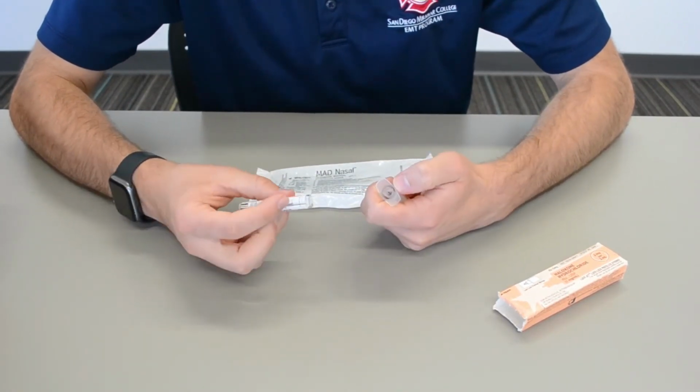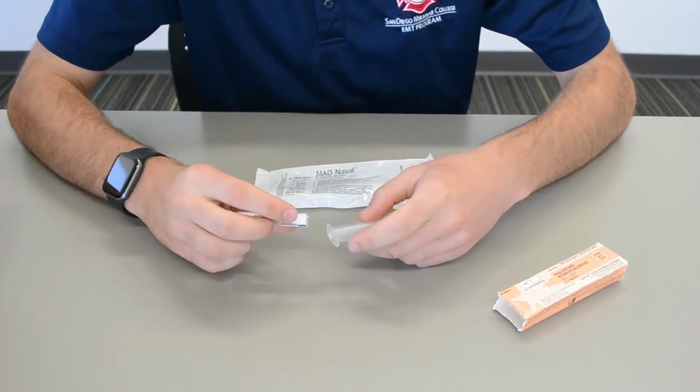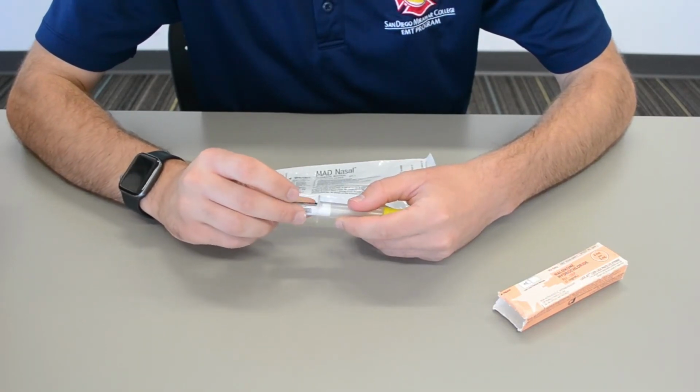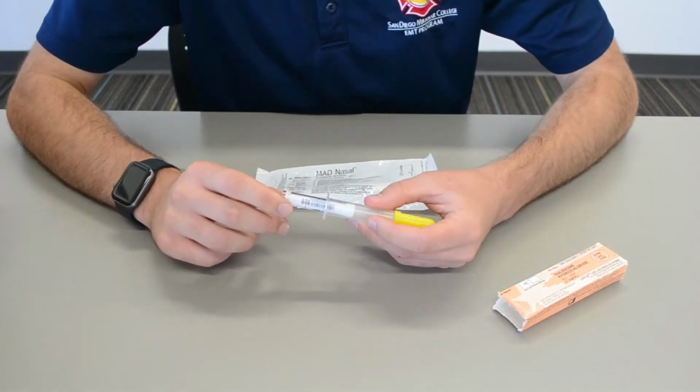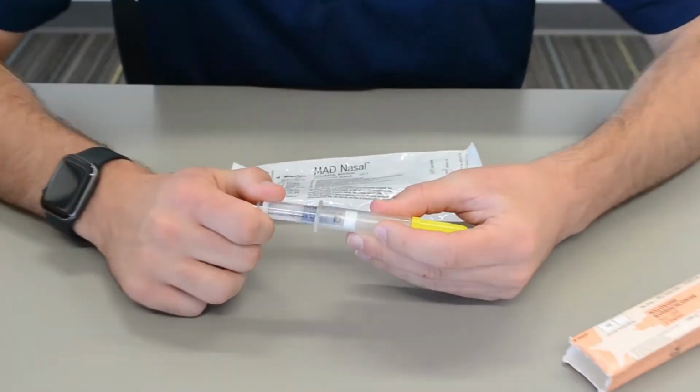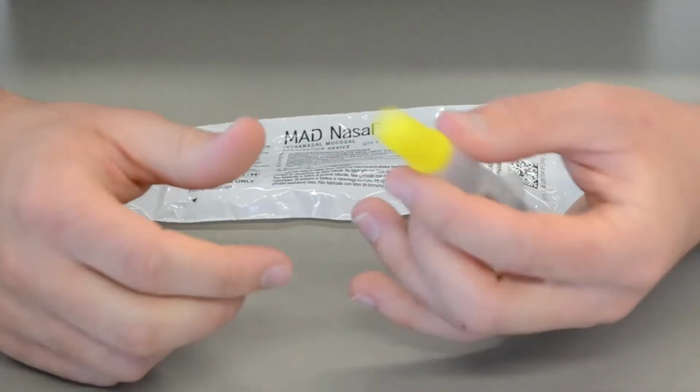So to connect this Narcan preload syringe, just go ahead and imagine with me that we've got a couple safety caps here. We pop those off, and then this, along with any other preloaded syringe, screws into itself. Make sure you don't push down on it. You want to just secure it so that it's all good to go.